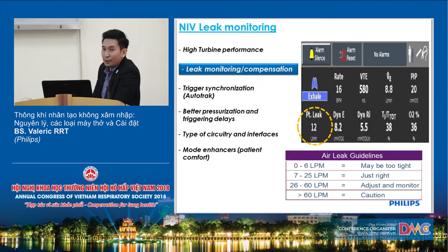Okay, so this afternoon we will have a workshop, face to face with the machine. I'll show you how the functions of this monitoring work later. Okay, so any questions before we proceed to my last slide for non-invasive ventilation, modes of ventilation?